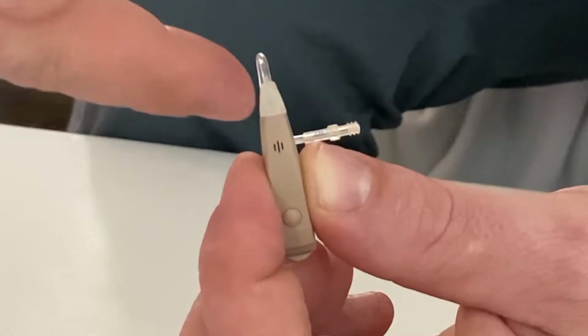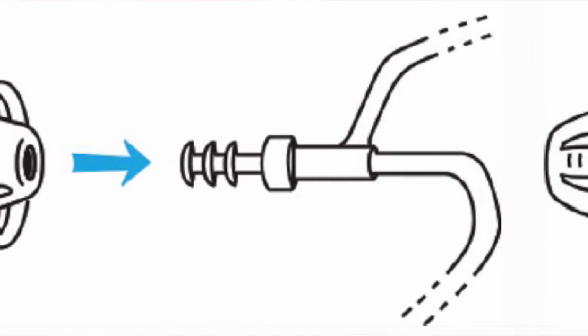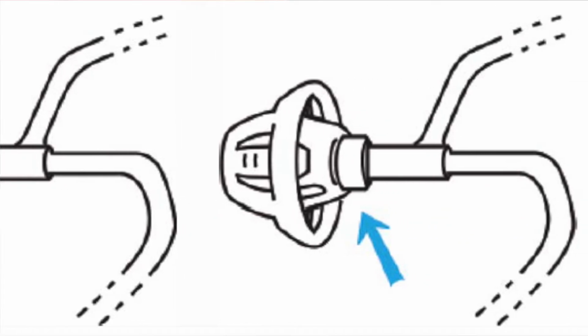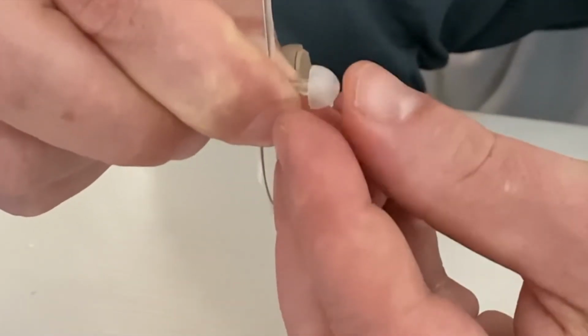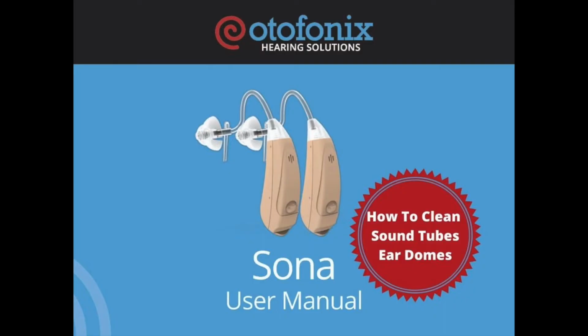For optimal performance, proper care and maintenance are imperative. In addition to regularly cleaning your tubing and tips, you should also replace them every 3 months. Over time, these items wear out and may become stiff, affecting both fit and sound quality.